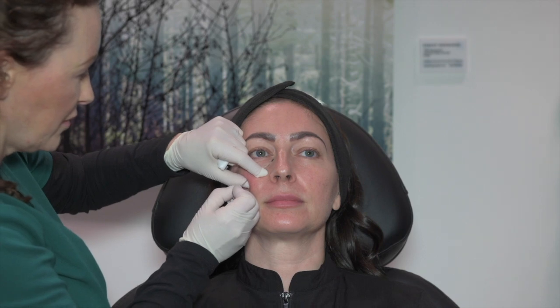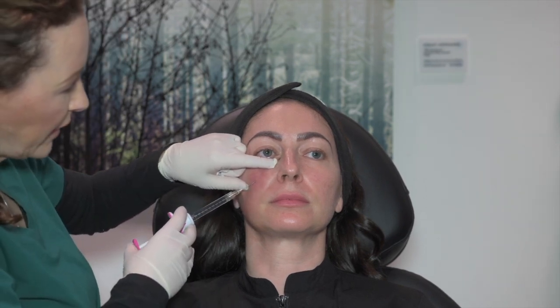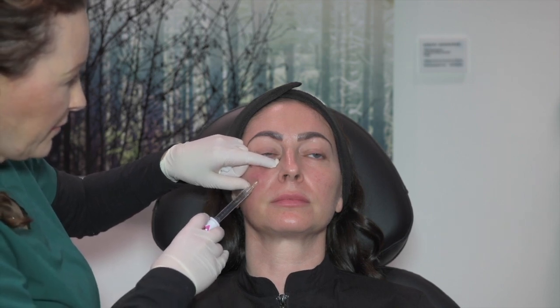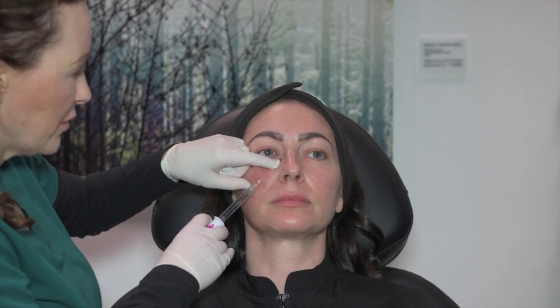Now we're going to move on to treat the tear trough with Voluma, and we're going to treat TT1, TT2 and TT3 with 0.2, 0.2 and 0.1. Going to pinch, and then we use the cannula to inject in the supraperiosteal plane, and my finger is feeling the infraorbital rim, and I'm using microaliquots.